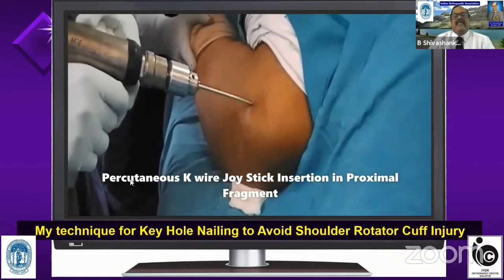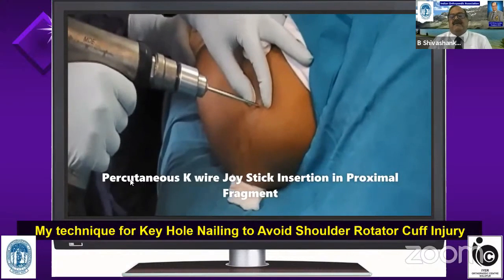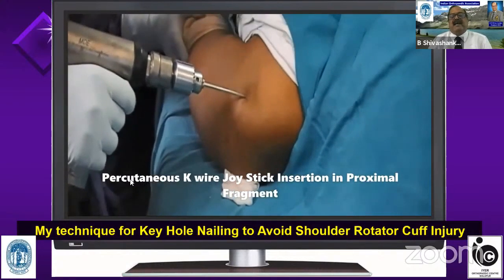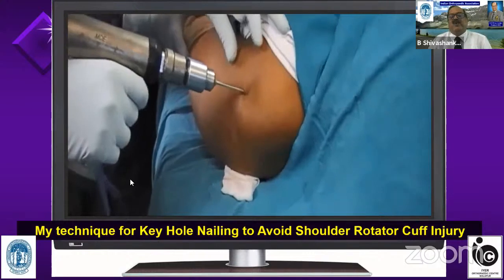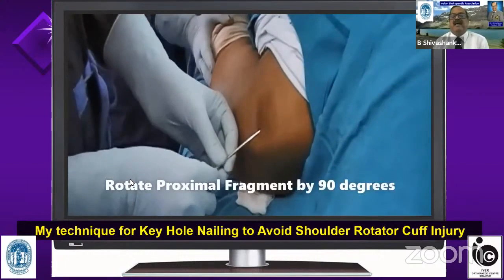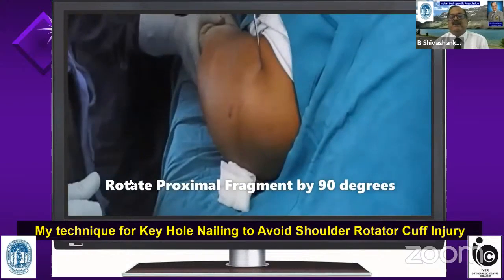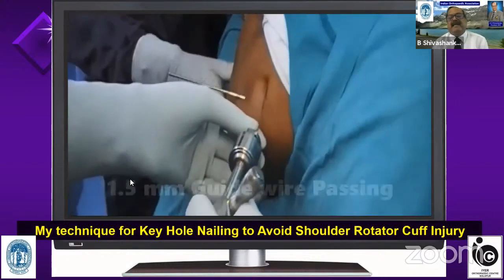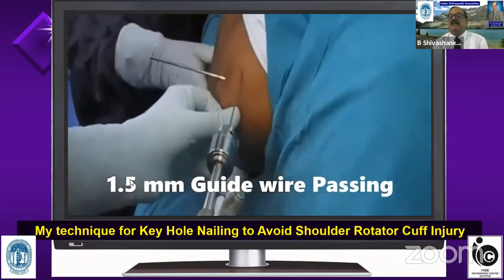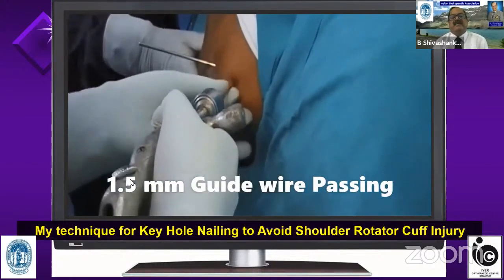You can see, in the proximal head, I insert a joystick K-wire. Percutaneously, I insert it in the head. This is only to have control over the rotation of the head. So this is how the K-wire, which is 2 or 3 millimeter, you can see I can rotate it by 90 degrees. So without changing the position of the C-arm, I can take AP and lateral pictures of the proximal medullary canal of the humerus. That is the reason why I use this K-wire.